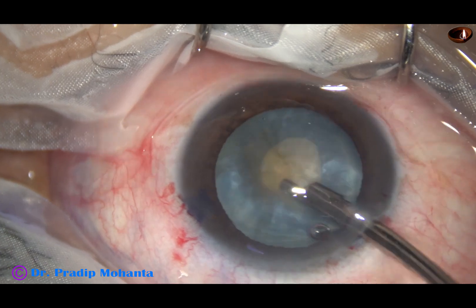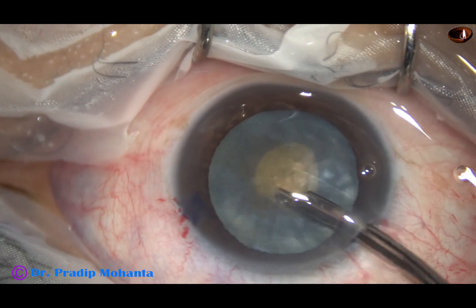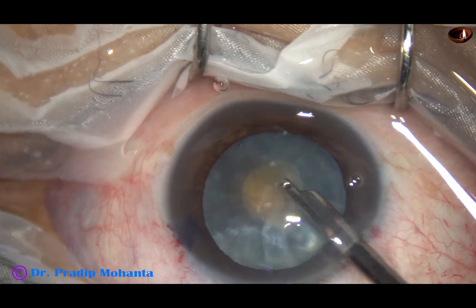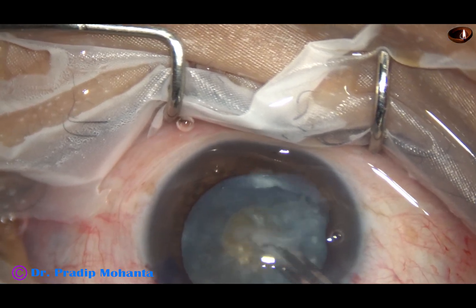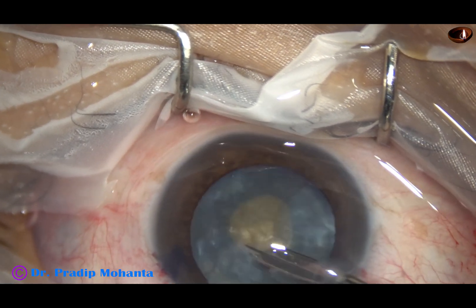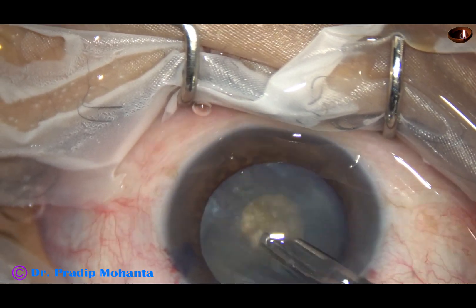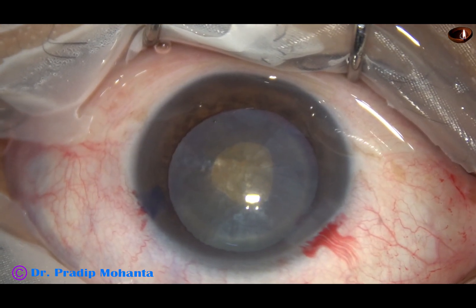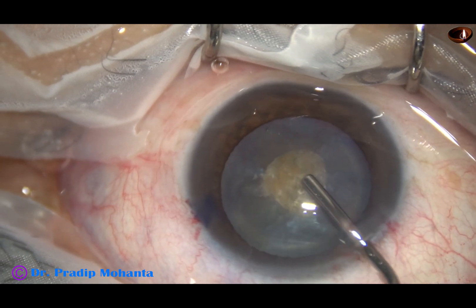Now some cortical lens matter is aspirated. As we do this, the intralenticular pressure is drastically reduced, and when we enlarge the rexis after this step, the chance of rexis run out will be almost eliminated.